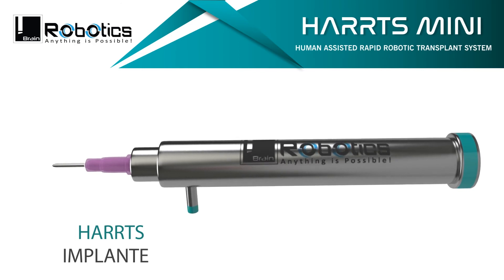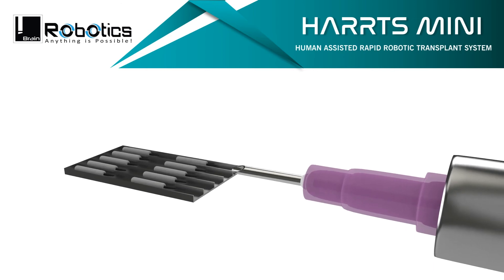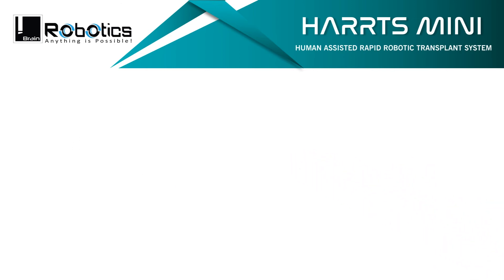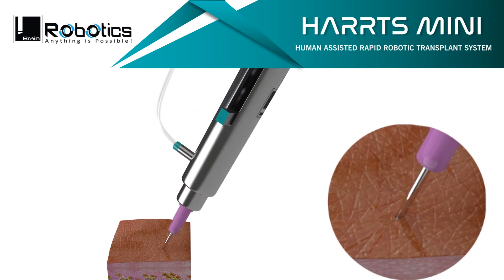The HARRTS implanter is the world's best robotic implanter, which self-engages the grafts by mild and safe suction and is capable of implanting without the need of creating slits in the recipient area, though it can be used with slits as well.